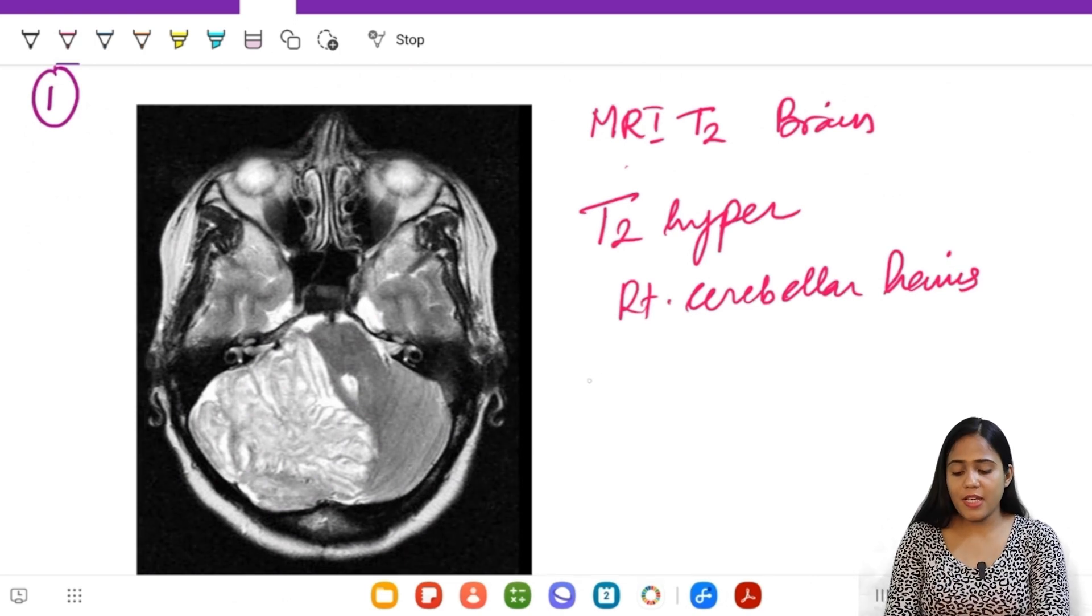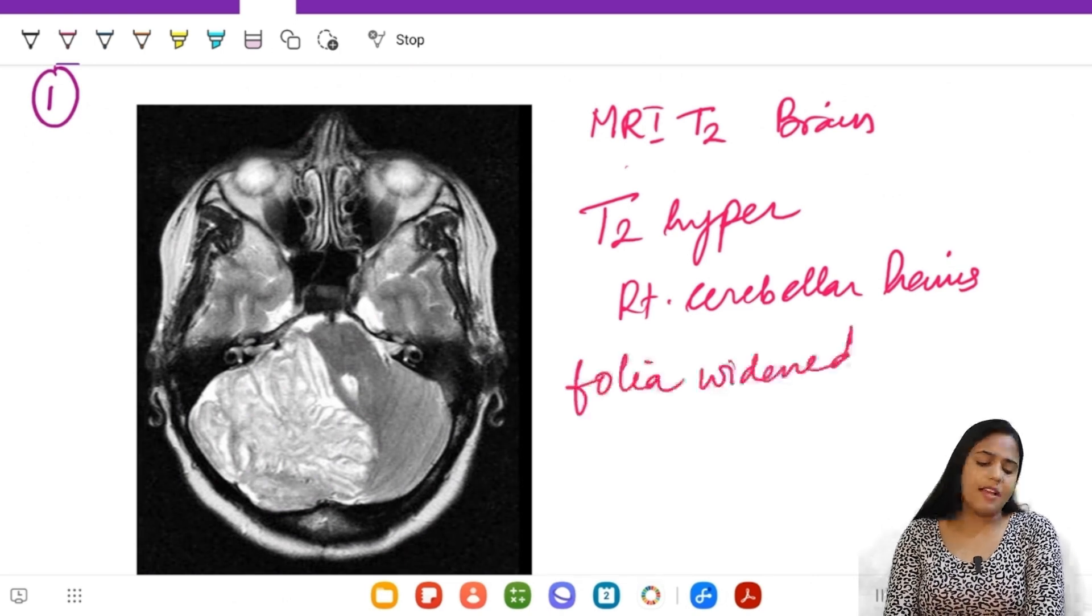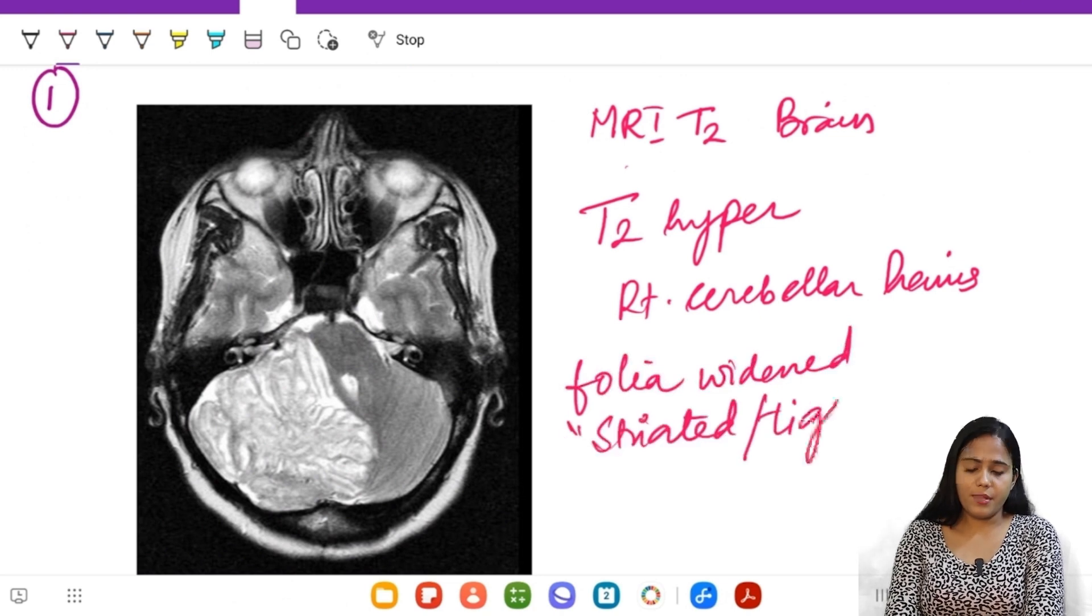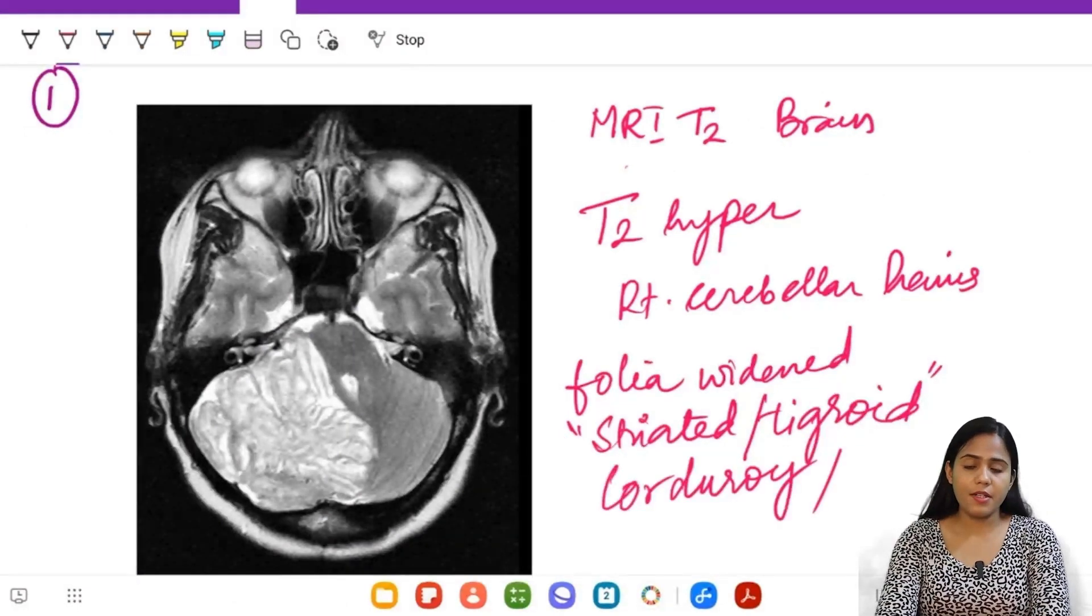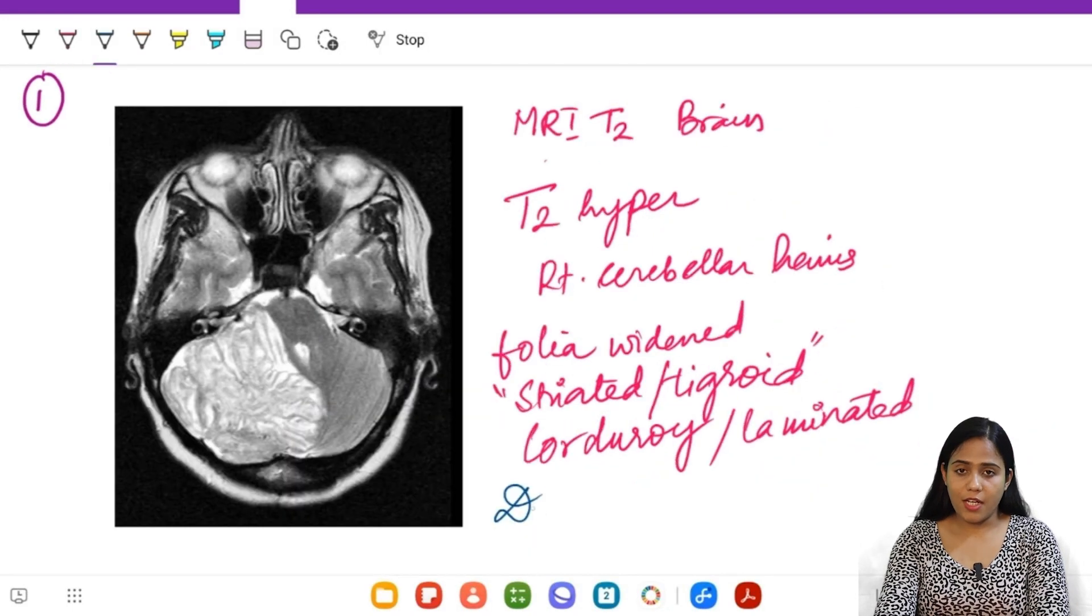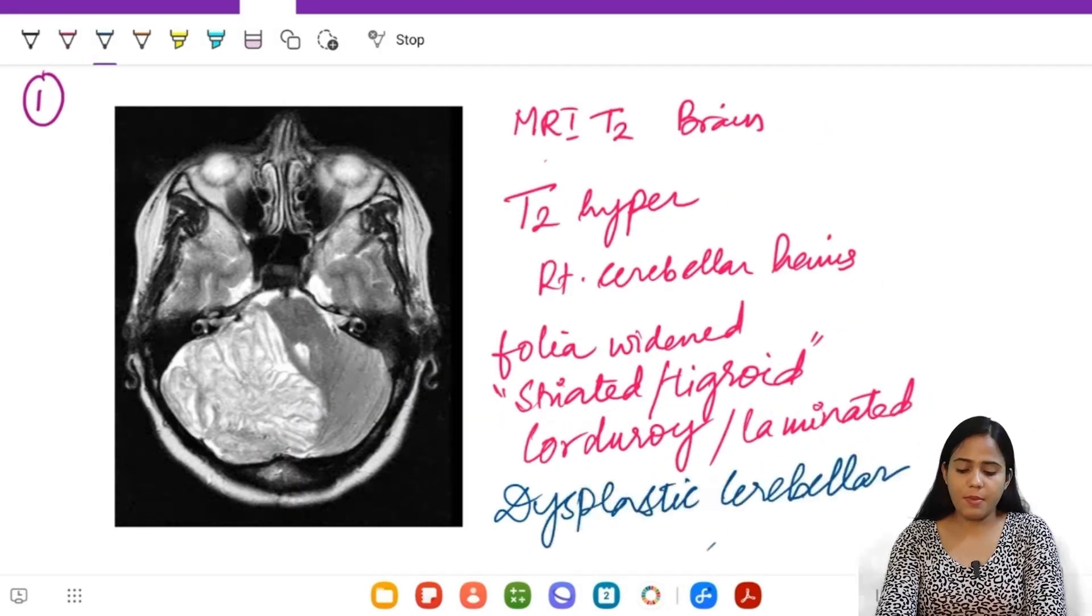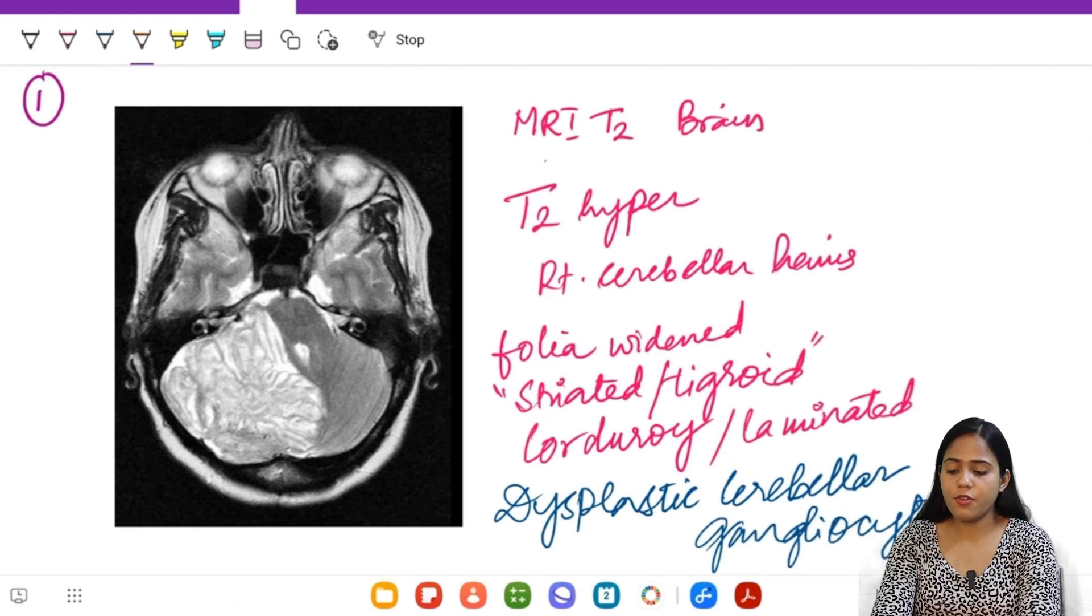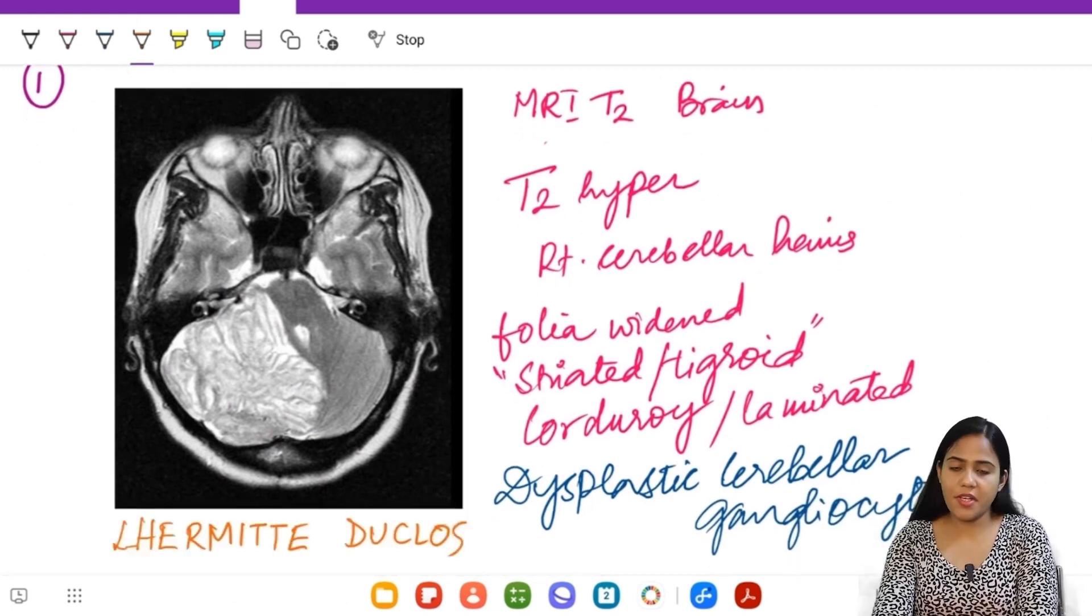We get this typical striated or tigroid appearance. Two other names for this appearance: corduroy cloth, another name laminated appearance. So what is the diagnosis? The diagnosis is a dysplastic cerebellar gangliocytoma, but important name that we should know: Lermite-Duclos disease.